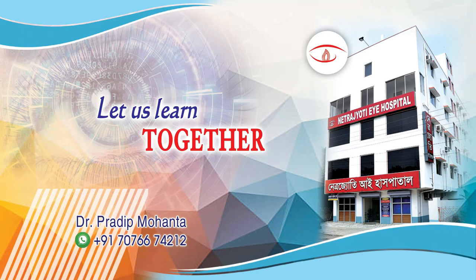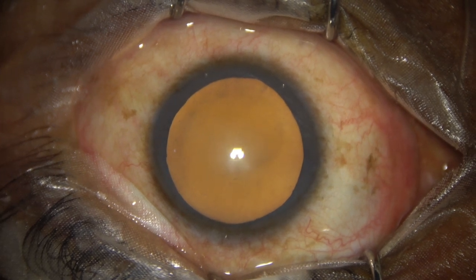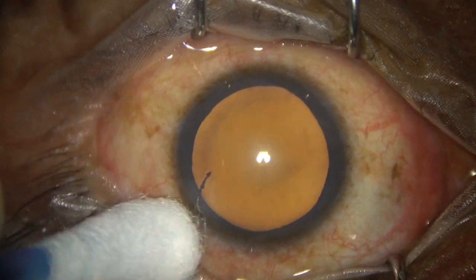Friends, welcome to my workplace at Ranakh Heart, West Bengal, India. This is a cataract with grade 2 nucleus sclerosis, so this is a soft cataract. Let us observe this surgery.